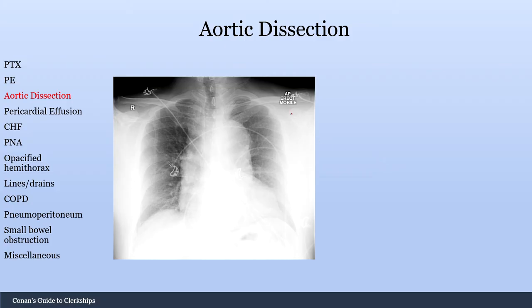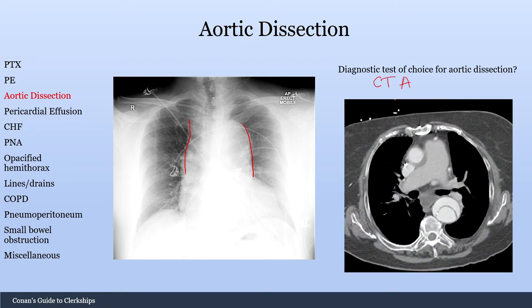Moving on to aortic dissection — the main thing you're looking for is a widened mediastinum. What is the diagnostic test of choice for aortic dissection? That would be the CT angiogram. Here's an example showing an aortic dissection with a true and false lumen — a double lumen appearance.